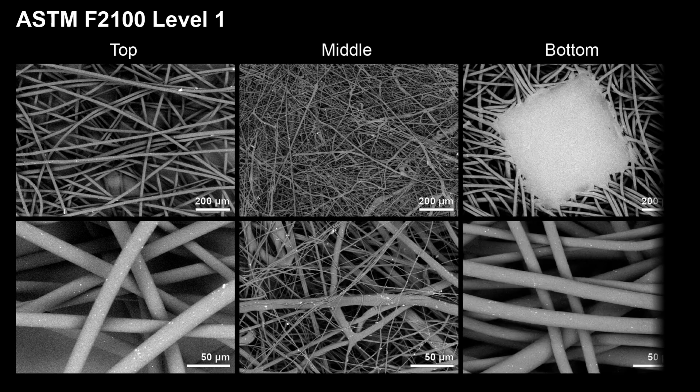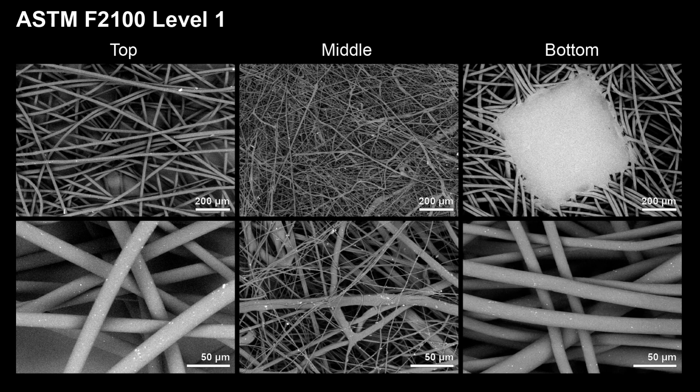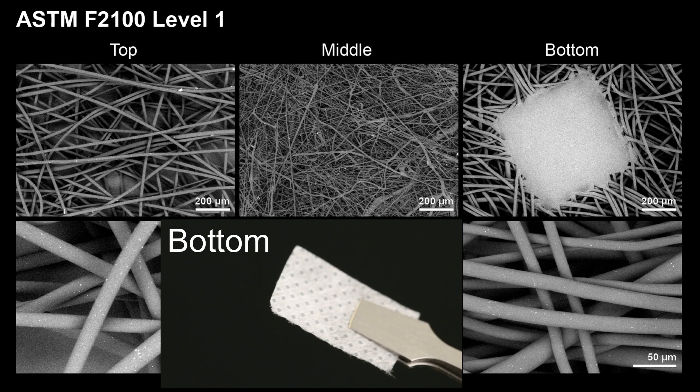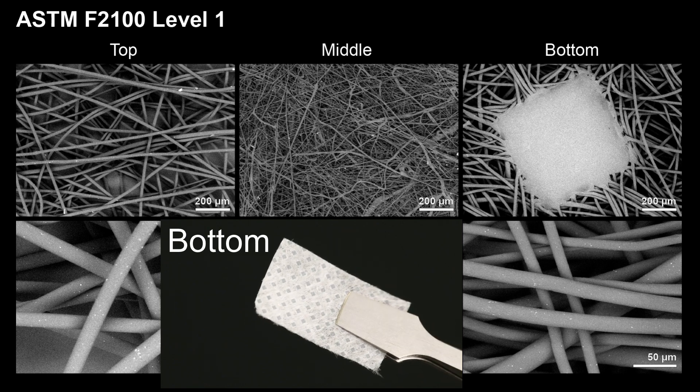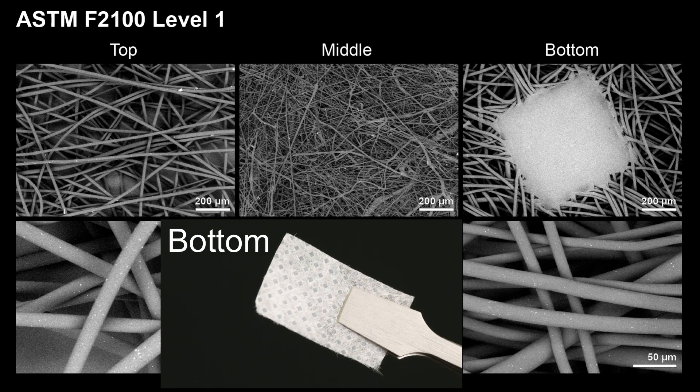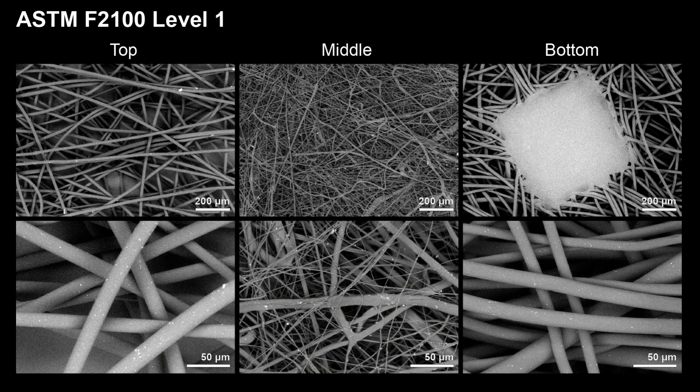Finally, in the low magnification image of the bottom layer, you can see a big square in the middle — that is actually part of the pattern on the mask that you can see with your eyes. Overall, the structure and fiber diameter of this non-woven layer is quite similar to the top layer. The main purpose of this layer is to provide comfort to the user as it is in direct contact with the user's face.